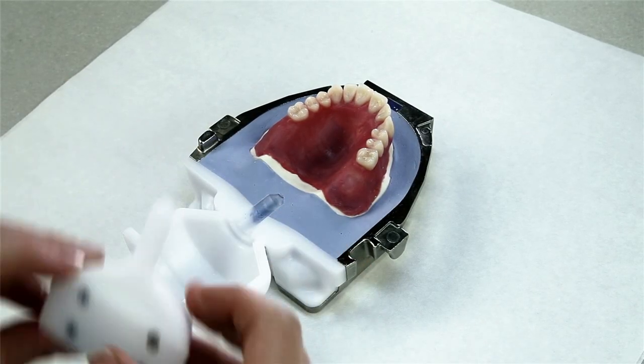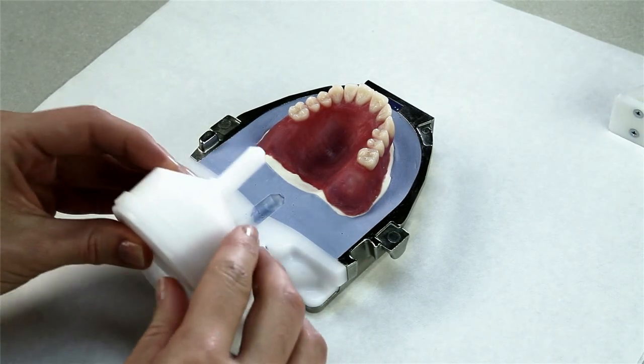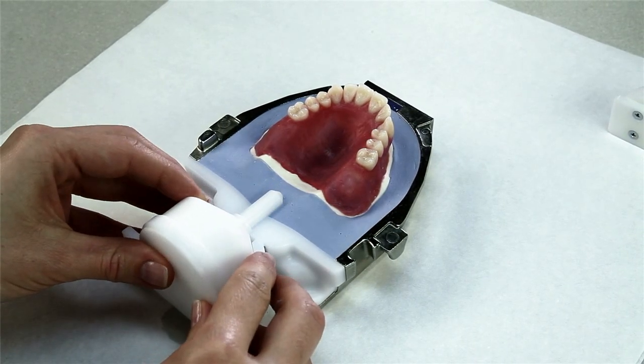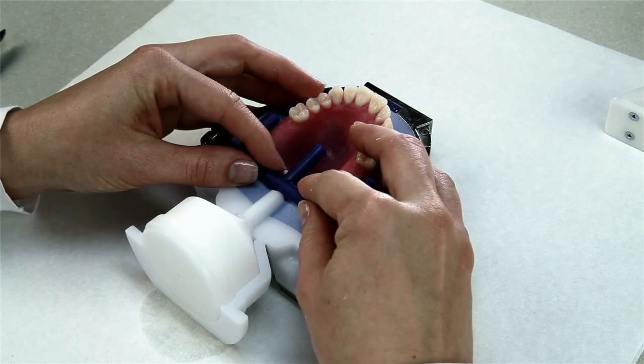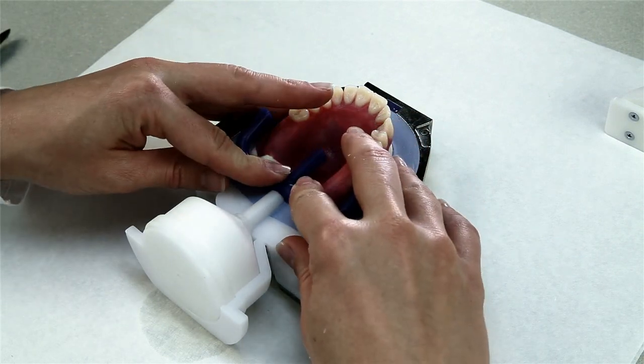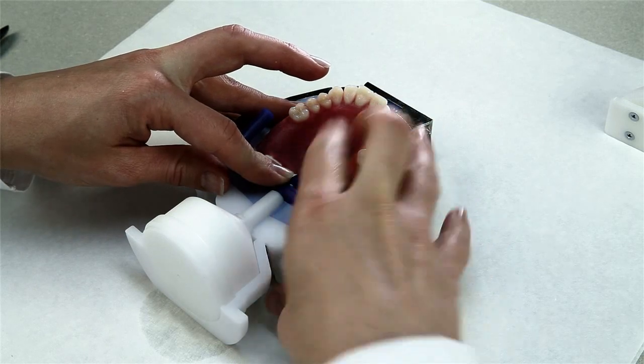Once the stone has completely set, replace the excess former half with the excess former full. The injection wax component may now be pressed over the conical tip of the excess former and to the stone surface.